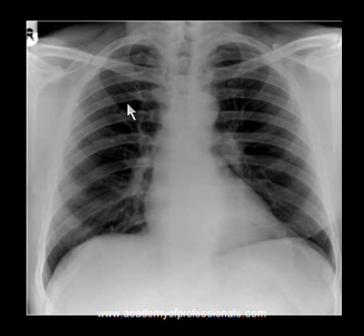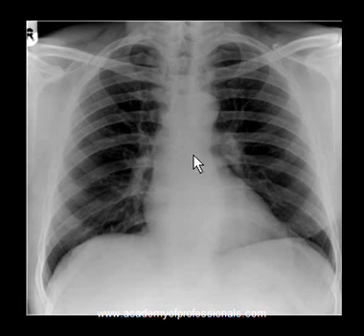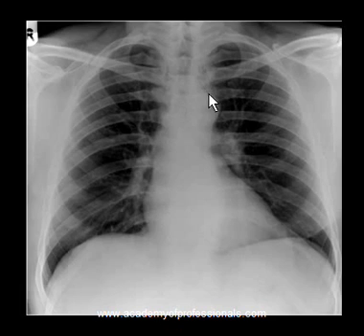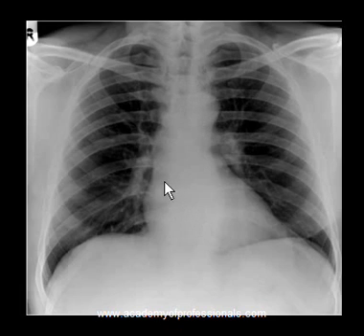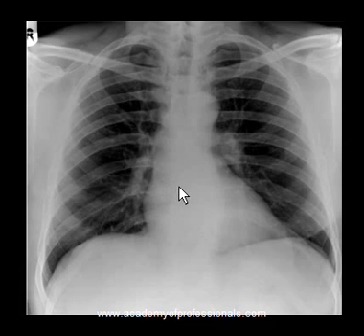Today's topic is right-sided aortic arch, although the x-ray in front of us is normal with a left-sided aortic arch. Right now I want you to pay attention to the normal appearance of the aorta on a normal chest x-ray.